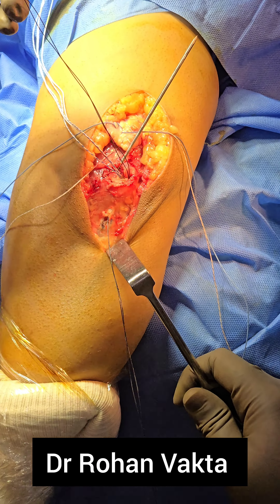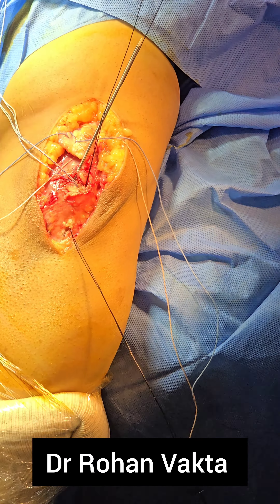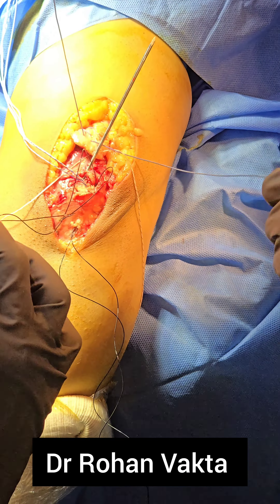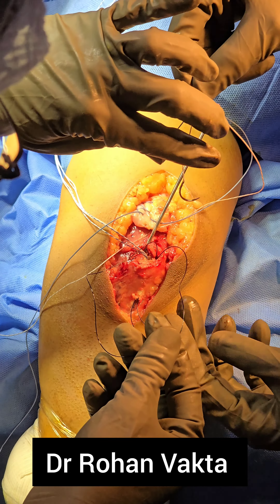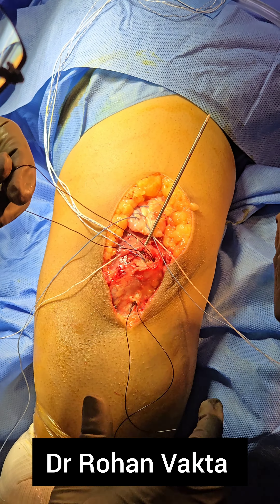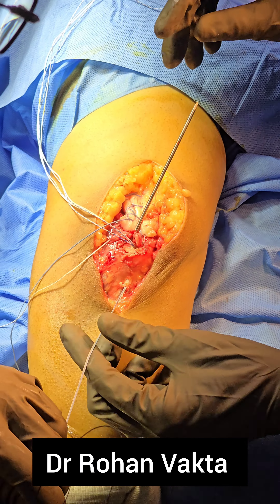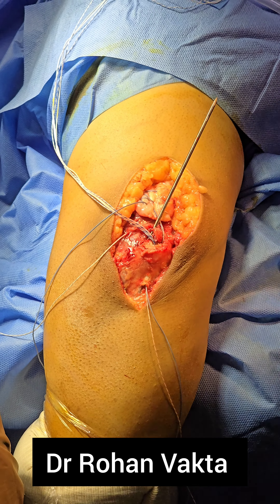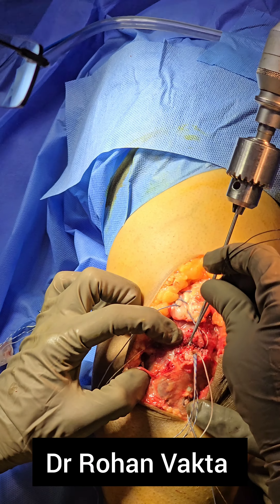A transosseous shuttle technique is used — a straight needle with attached ethylon loop is used as a shuttle suture. The previously passed fiber wires in a Krackow fashion are passed through this tunnel, with one medial and one lateral fiber wire passed through the middle tunnel. In this way you will be able to reduce the triceps tendon completely over its footprint. Just like a double-row repair of the rotator cuff, this will also act as a double-row transosseous equivalent repair.